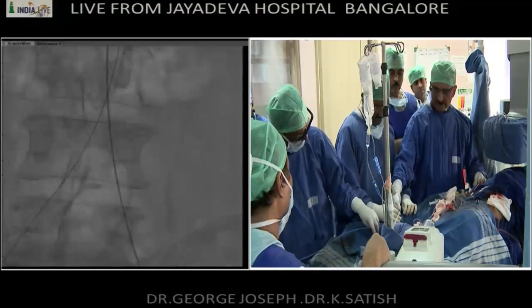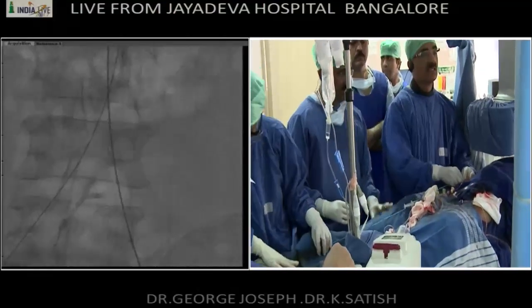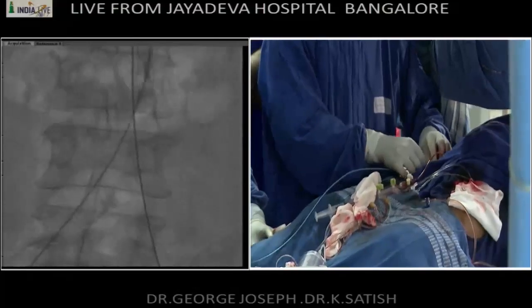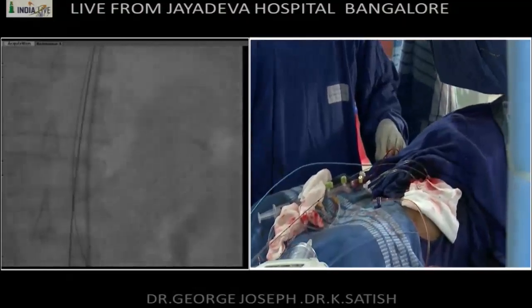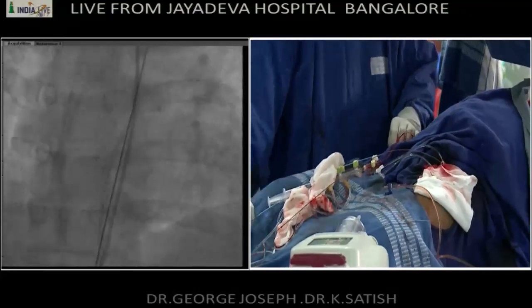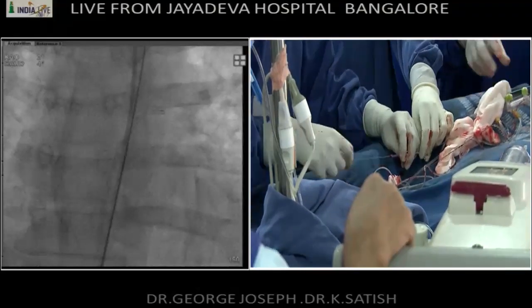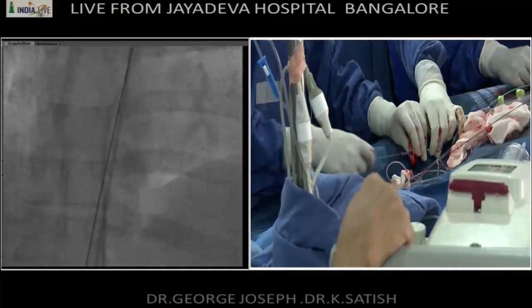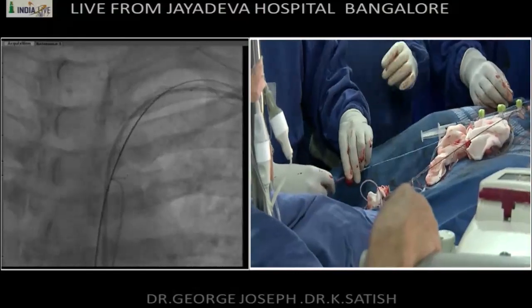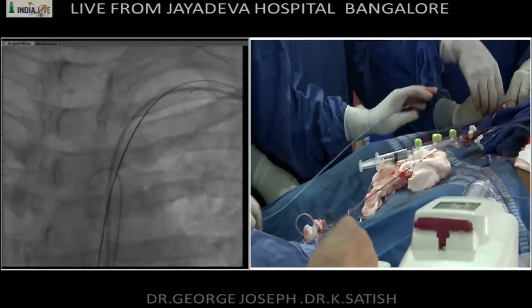Okay. Follow it up, please. Dr. Trehan, the other issue he wants to mention is support for tracking the stent, which on Terumo may be a little less. I don't think support is a real issue. Everything is very close and straight, and they have already worked up that area. I think the handling is the part. Stiff wires are sometimes difficult to handle, especially if you're not careful, it may slip out. But since you have a lot of length with you, I don't think the wire will slip any more.